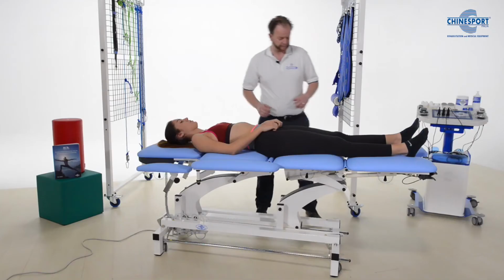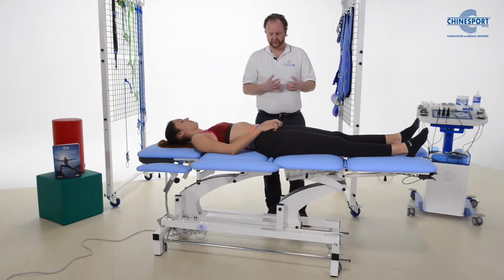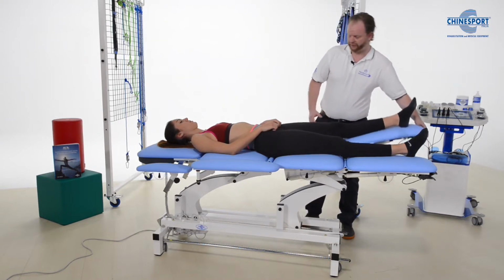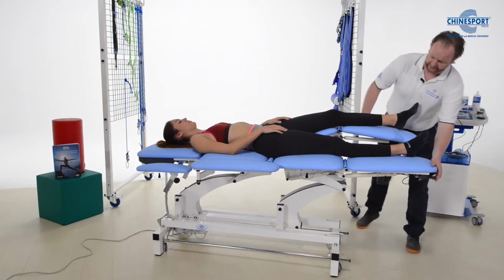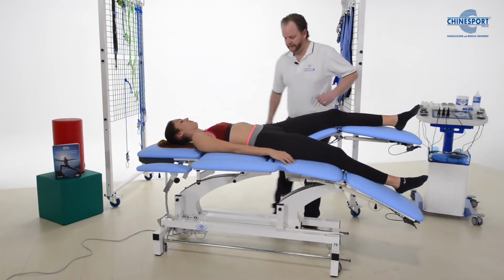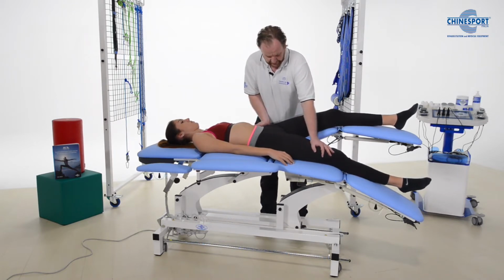some traction. In the next phase, usually what we try to do is we try to go into some stretching. People will often have problems with the psoas muscle, for example, so what we can do is we can bring up this side, we can lower that side, and we can go into a psoas stretch and just relax and continue breathing normally.